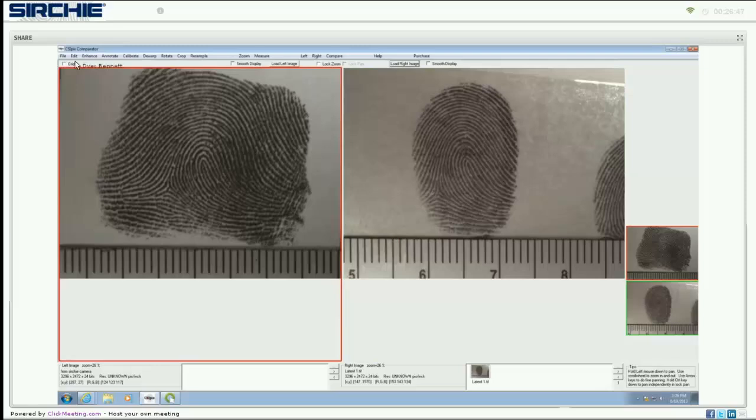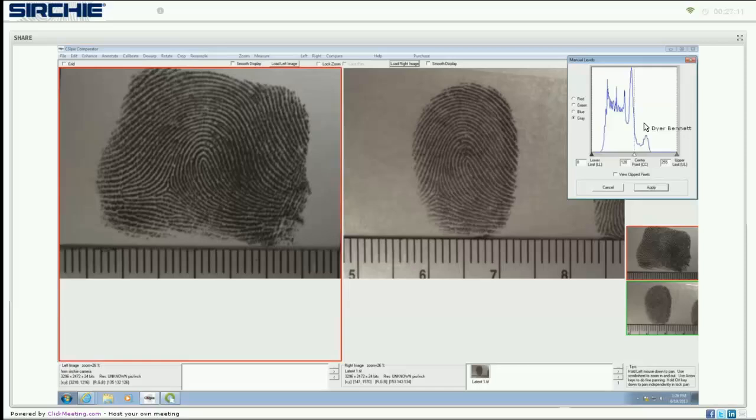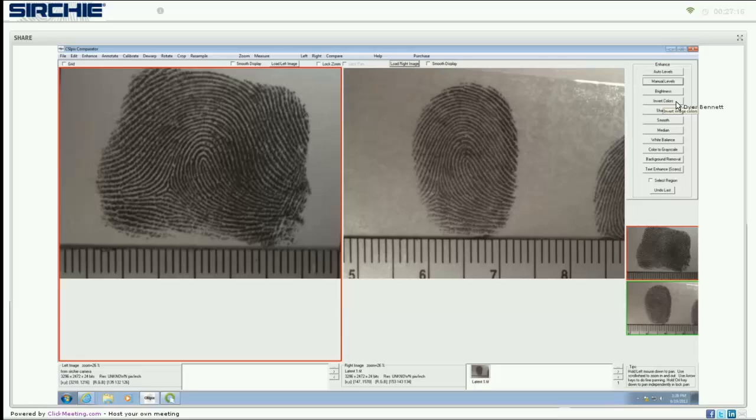The edit functions are typical: undo of last functions and copy to clipboard. Enhancements allow you to do basic photography enhancements similar to Photoshop — you can level (which is a balance function), manually level different colors, adjust brightness, invert colors, sharpen or smooth, apply median balance, white balance, change to grayscale, remove background by eliminating different colors, and enhance text or written elements.